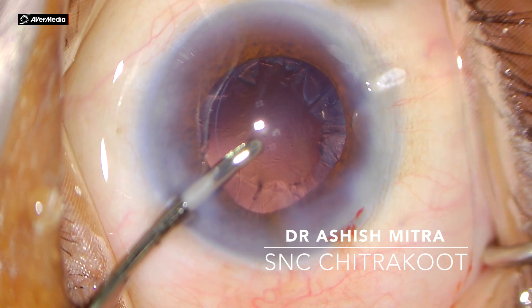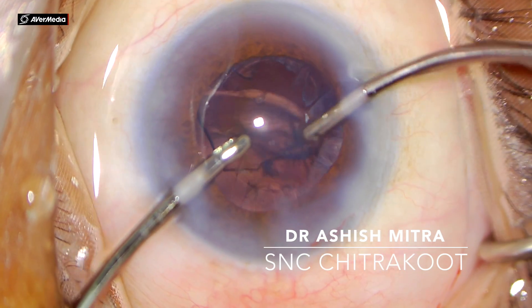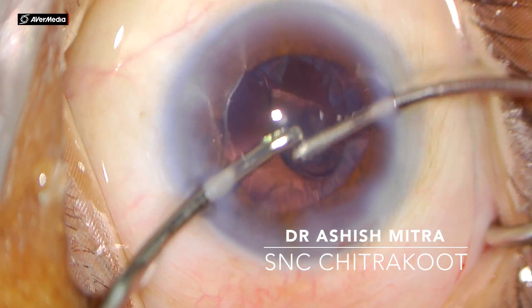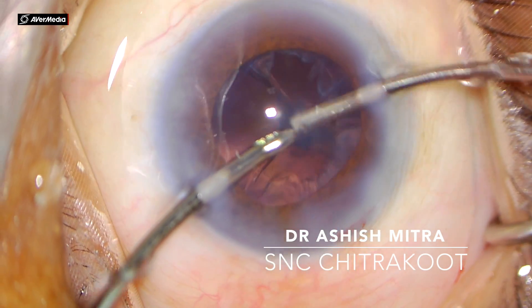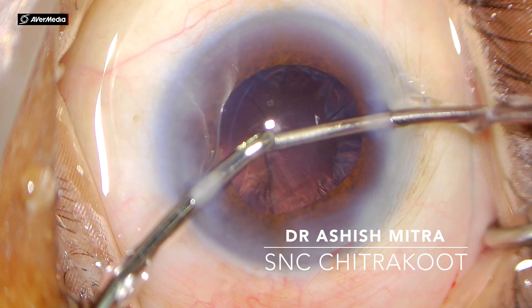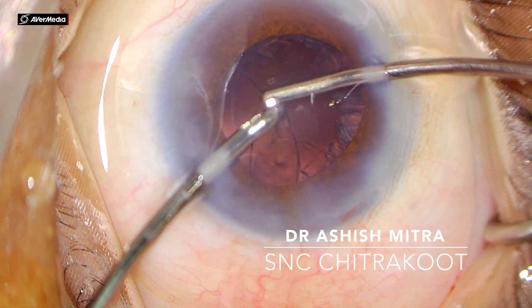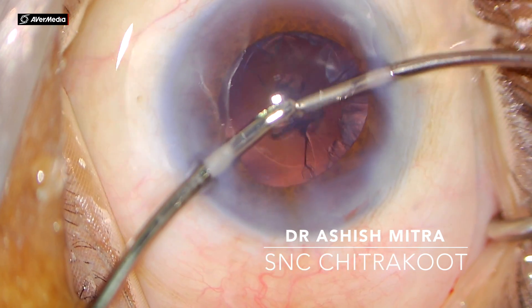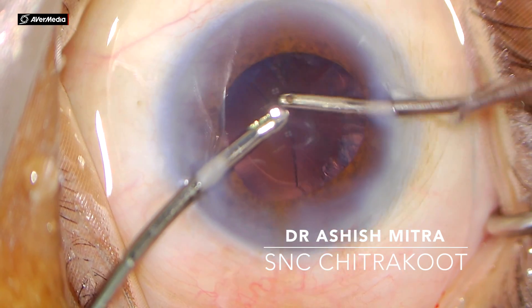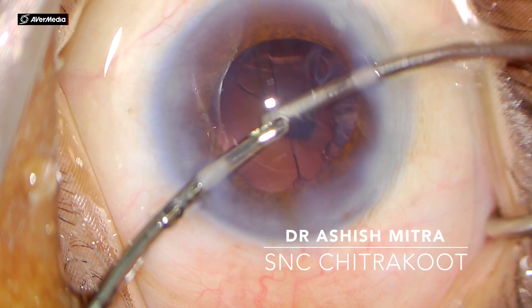You have to clear the cortex all through 360 degrees. Sometimes you require polishing of the posterior capsule as well — be gentle. At times when you peel the cortex it can be quite big and get stuck in the opening of the aspiration cannula. You have to manipulate with the tip of the irrigation cannula, as you can see me doing, so that aspiration of the cortex becomes easy. Similarly, all the cortex is removed one by one.